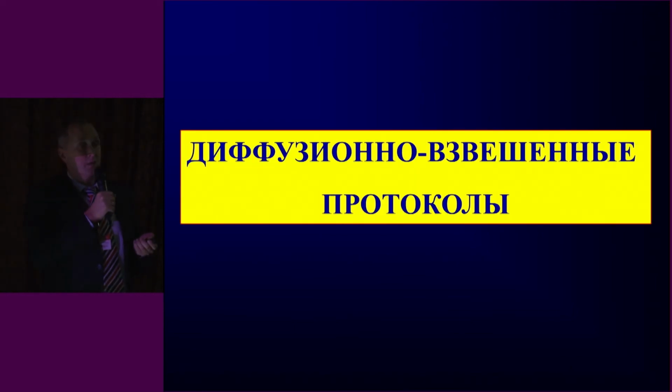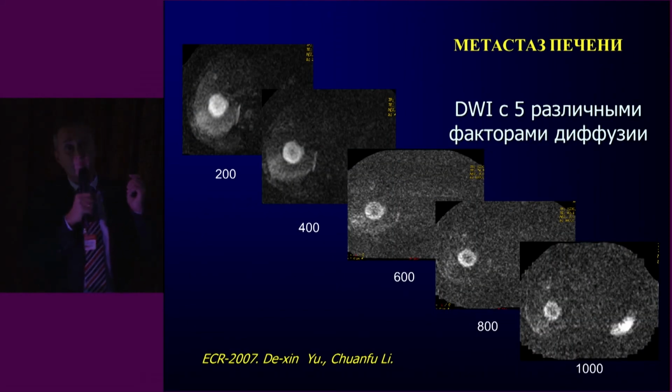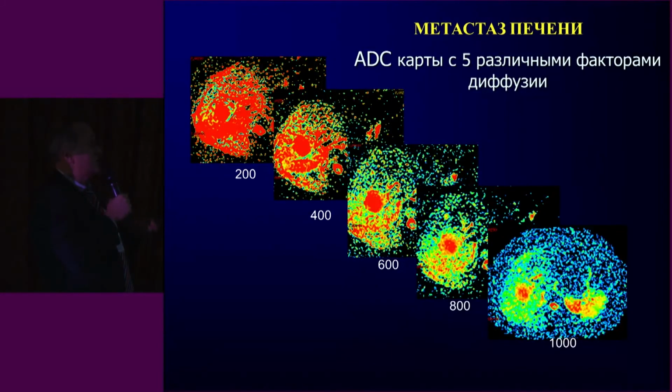At the end, I cannot but mention tomorrow. So we'll see in the future. Of course, it's diffusion-weighted protocols, which, without the use of any contrast, without the intravenous administration of gadolinium, make it possible to see secondary focal lesions and differentiate them.